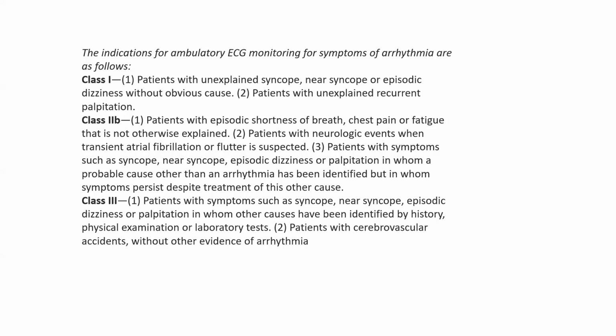It is not indicated in patients with symptoms such as syncope, near syncope, episodic dizziness or palpitation in which potential causes have been identified by history, physical examination, or laboratory tests.